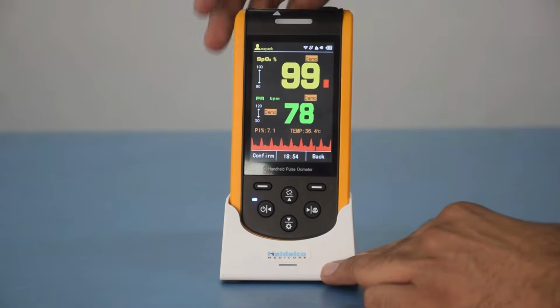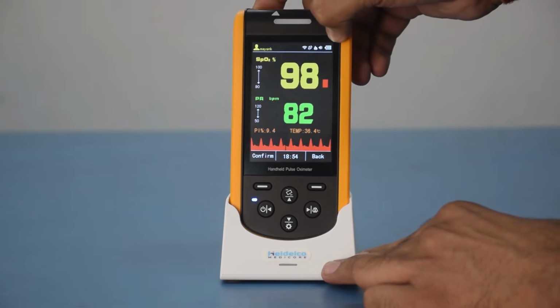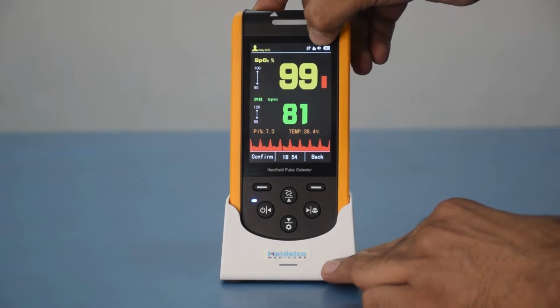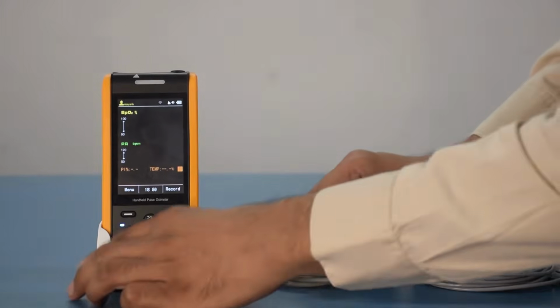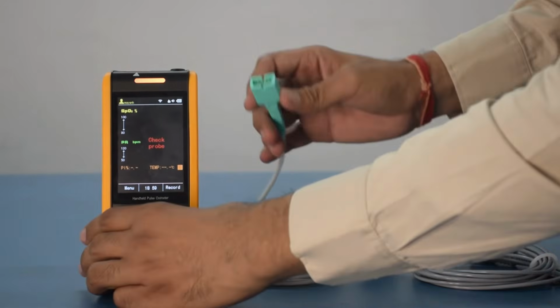On the top area you can see the patient name, and on the next side of the top area you can see the battery indication, alarm indicator, patient connection indicator and a rotator. And this is the keypad area. In this equipment we provide all three types of SpO2 probe: adult, neonatal and pediatric.